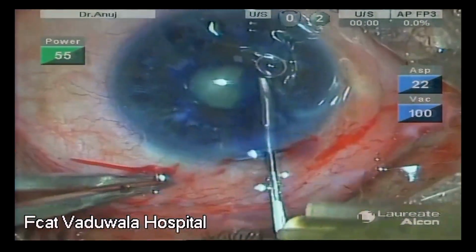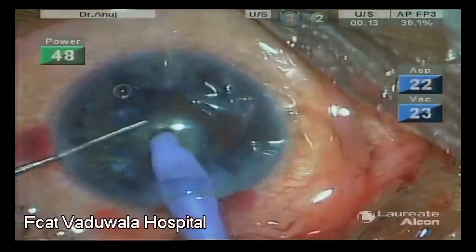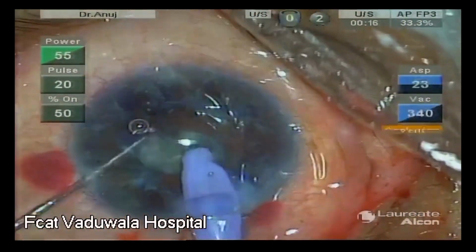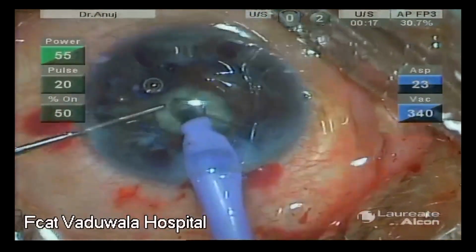If the depth of the central well is correct, we will be able to conduct successful chops without catching the iris in spite of the pupil being extremely small. Nudging the pieces towards the centrally anchored phaco tip helps in such cases.